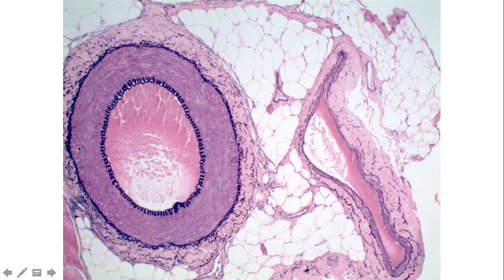And so here's our first histology slide, and this is used to illustrate two very extreme, nice examples of an artery on the left and a vein on the right. If we take a look at the one on the left, we'll notice that it has a nice circular lumen. This is the central area of the lumen where the blood would be. You'll notice on the right in the vein that the lumen is collapsed.